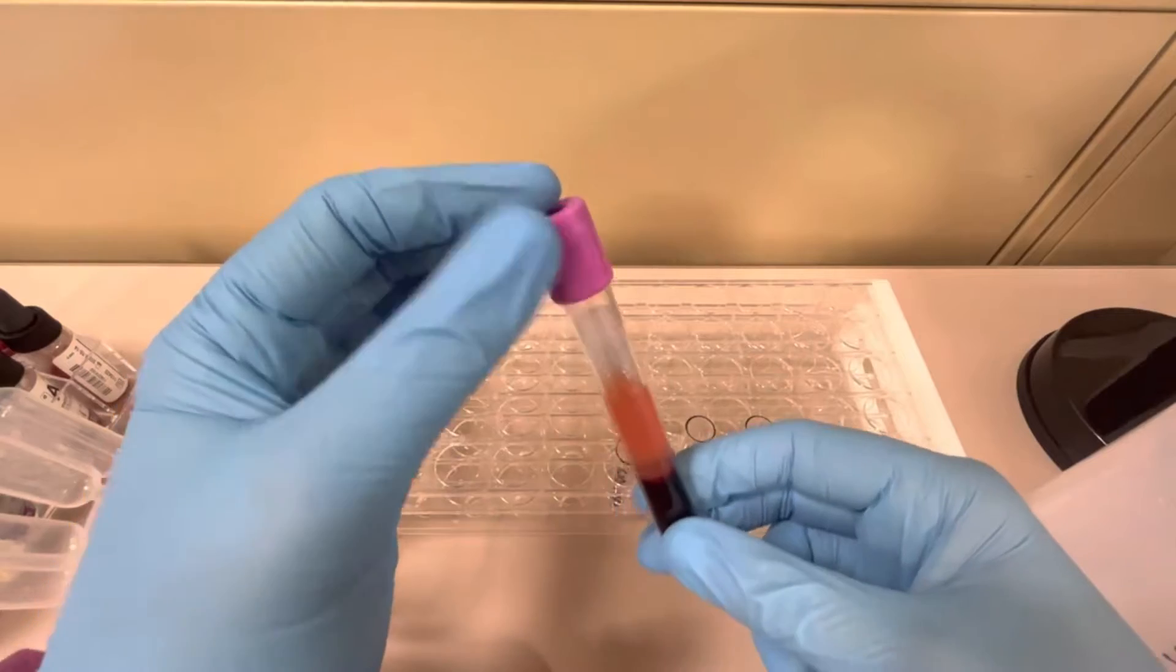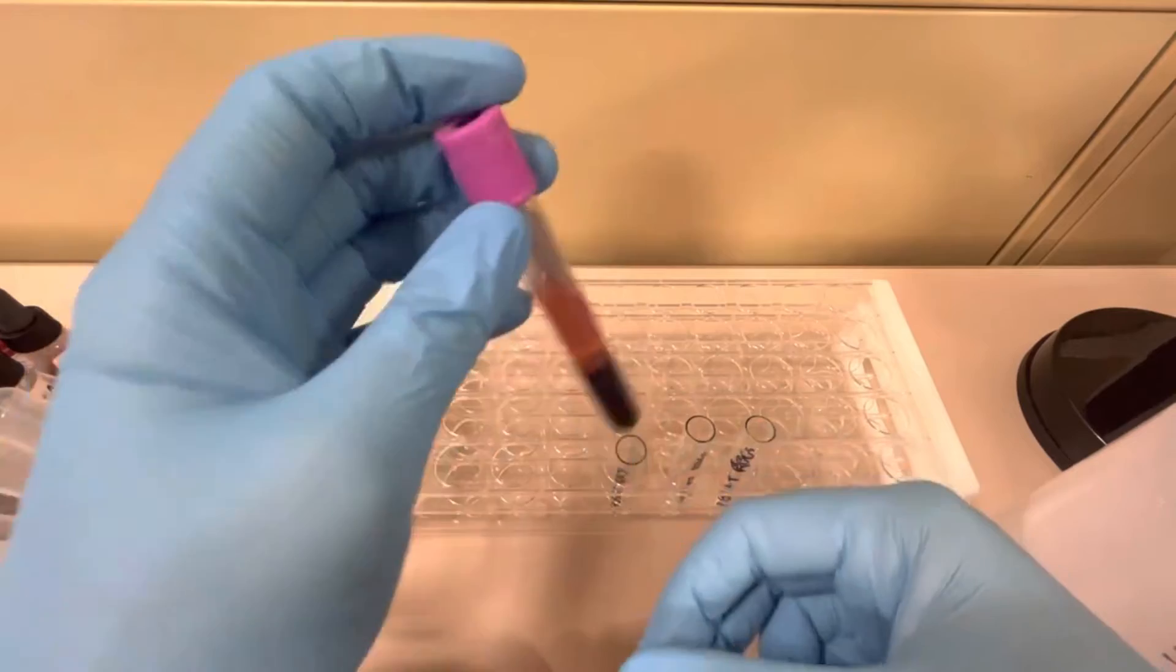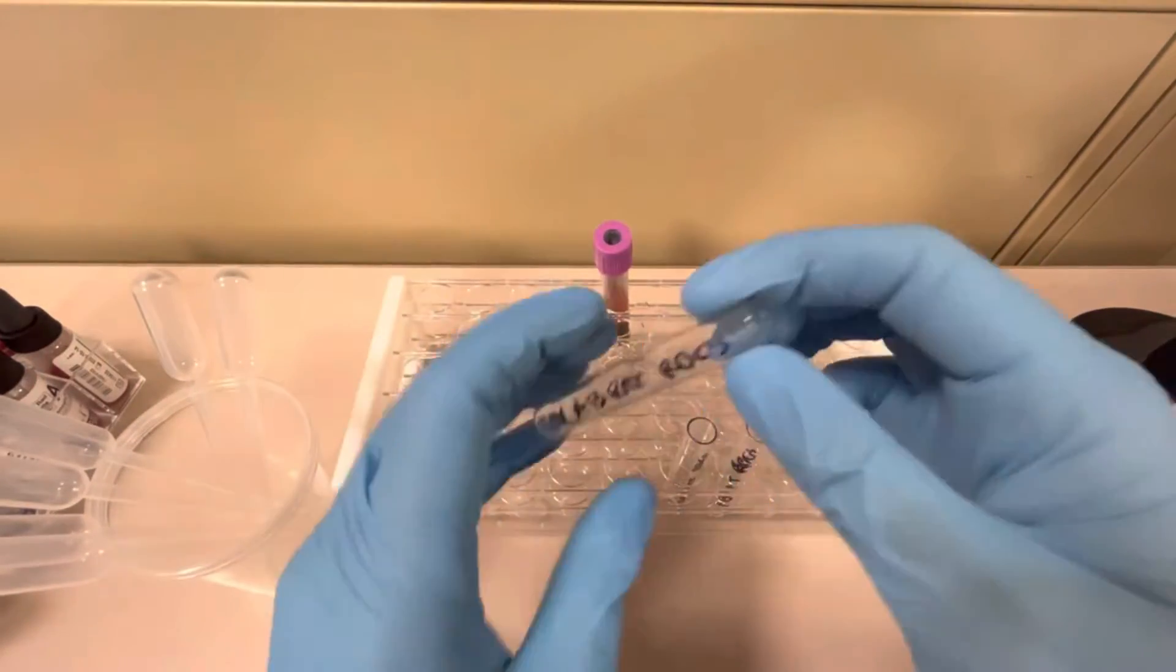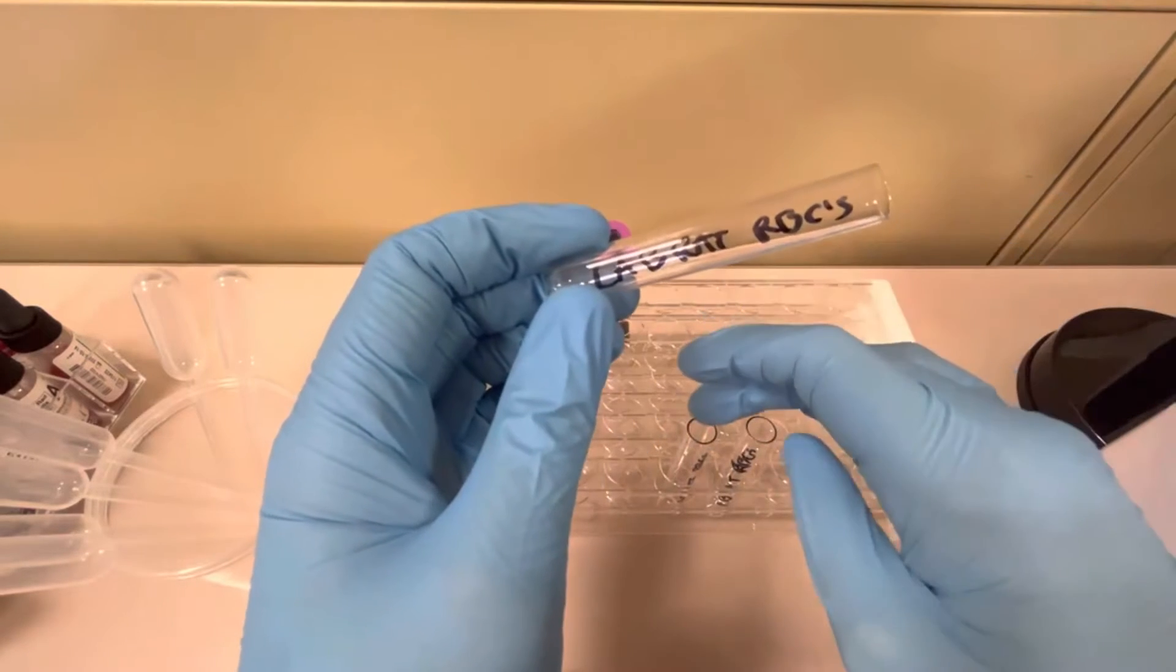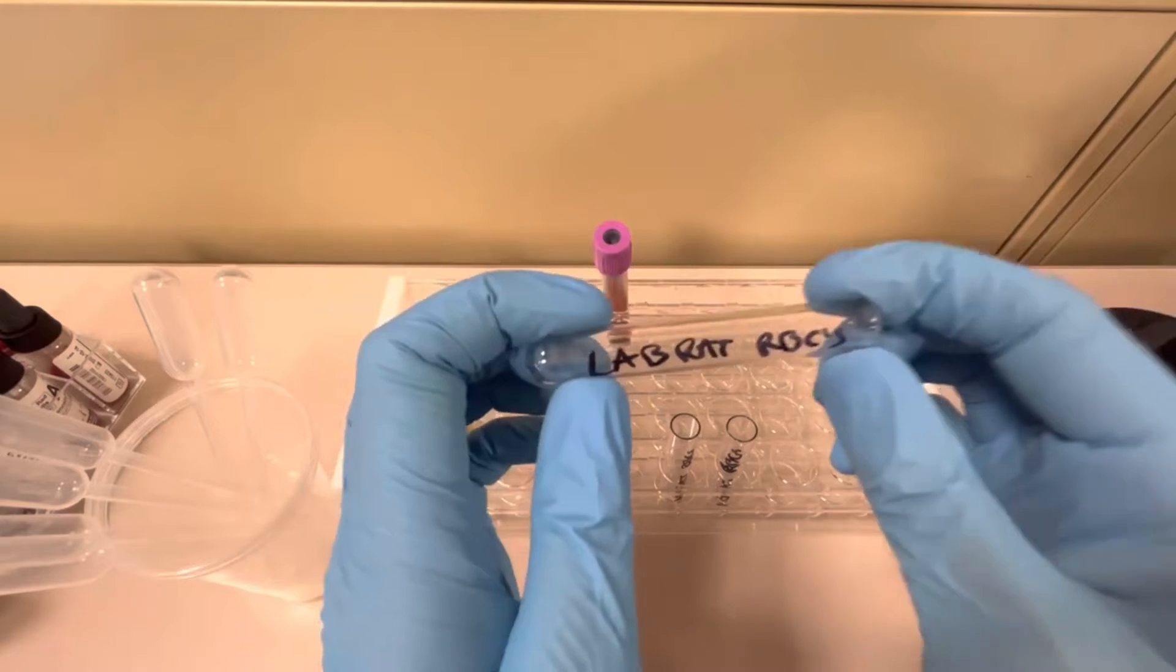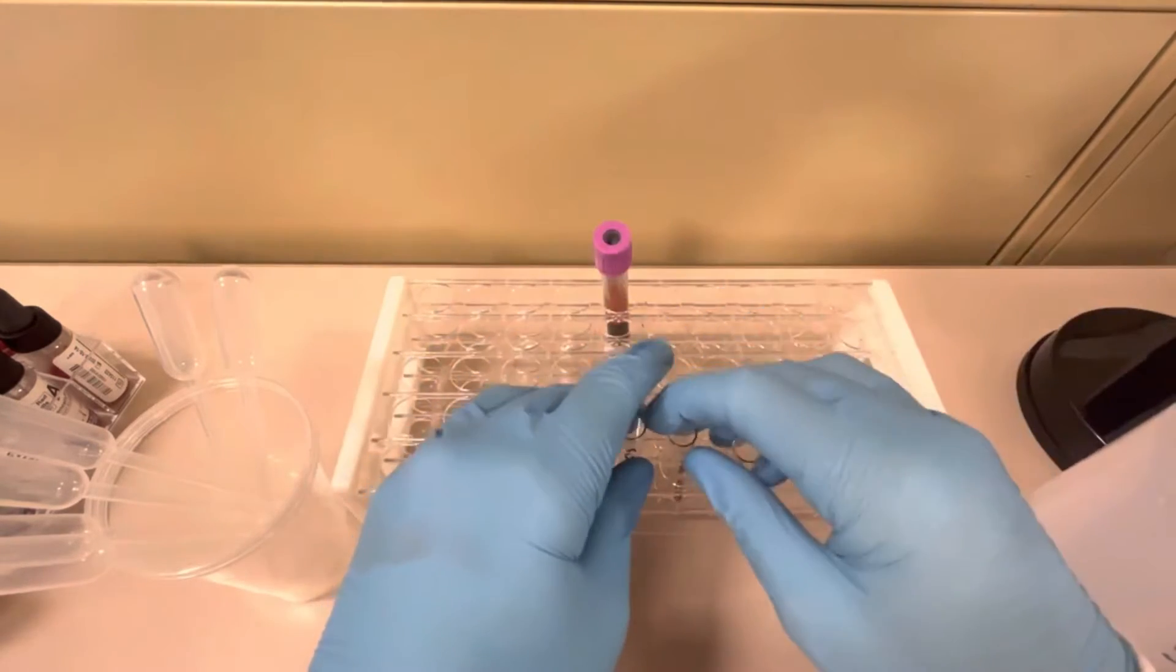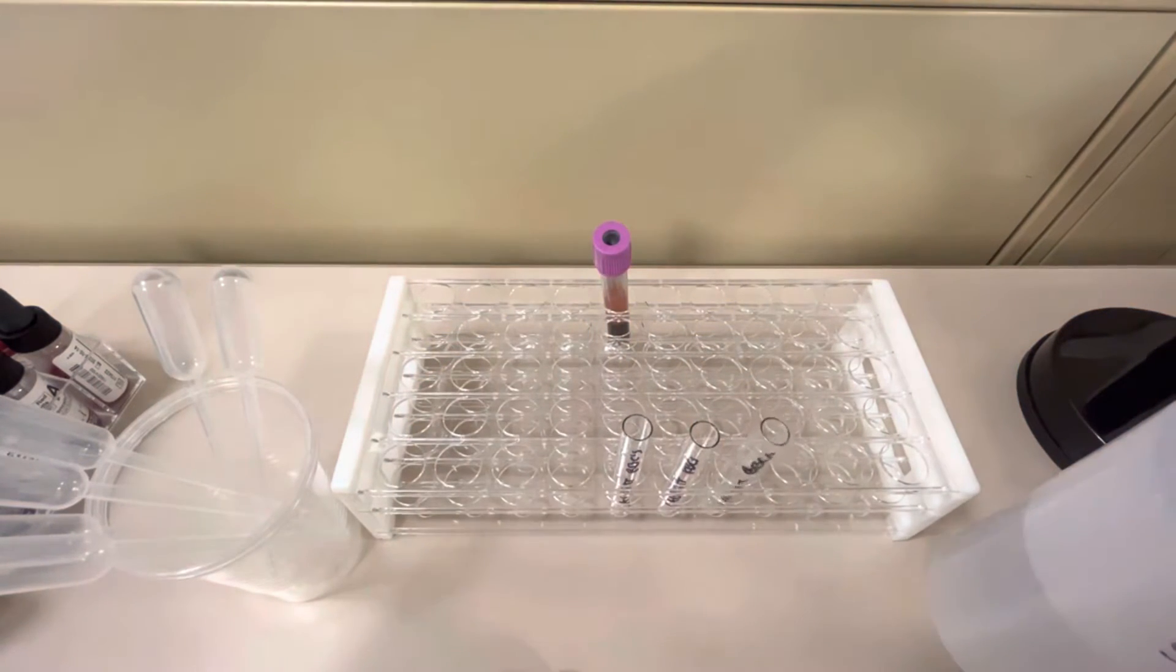It's in a correct tube so you can use an EDTA specimen, either lavender top or pink top for this. So we have a properly labeled specimen. Now we also have some glass tubes. Technically you only really need one, but I'm going to show you what happens if you put too many red blood cells in or too few red blood cells in and then of course the correct one. So this one is labeled Lab Rat and then I just put RBCs on it. I have disposable pipettes, my blood bank saline, and I'm ready to go.